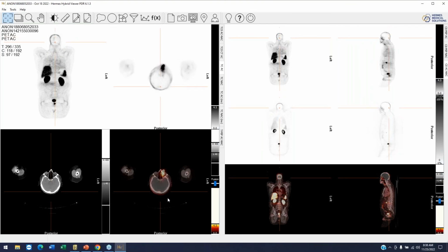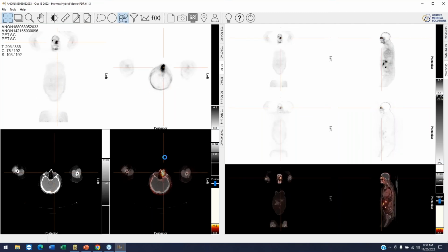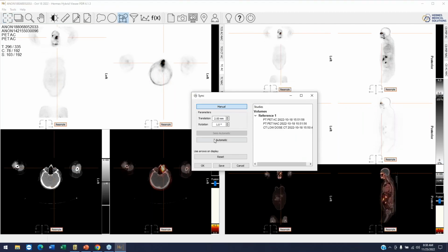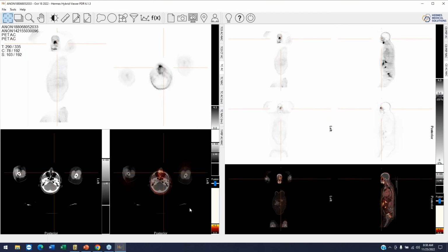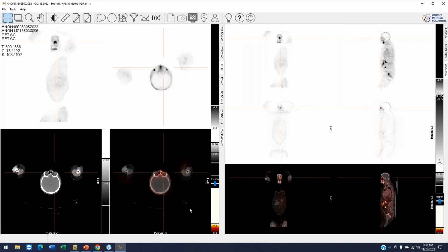And this would require, if there happen to be pathologic sites, whether it be cervical nodes, or if you're trying to differentiate whether the lesion is in the brain or the calvarium, it's important to appropriately co-register images. So if I take this and just use the registration tool, you can see the arrows appear, and I can, on the fly, quickly move it over and press OK. And you can see it's completely appropriately co-registered. And you can see the value of it, like if you had pathology in the cervical nodal stations or the brain or the calvarium.